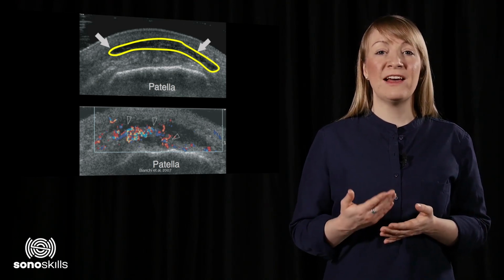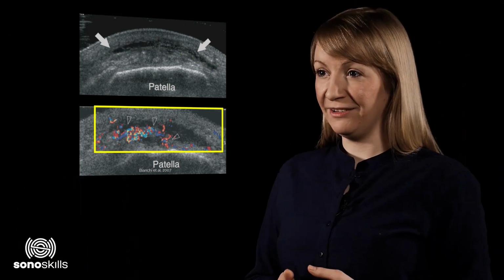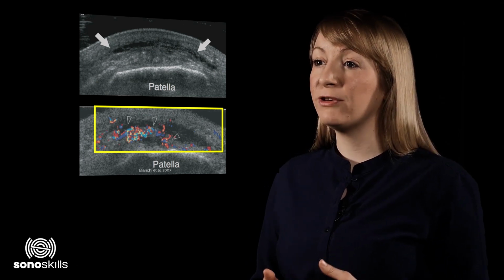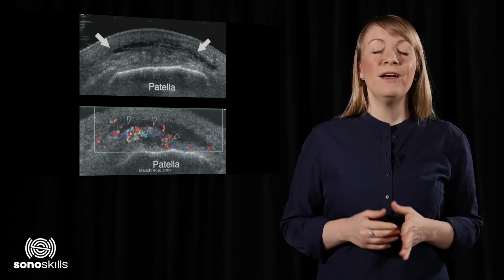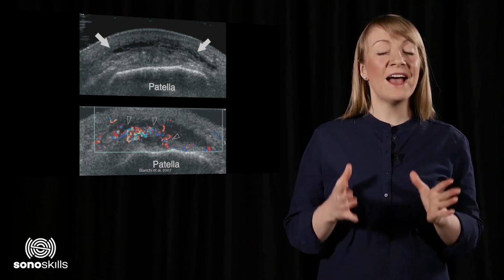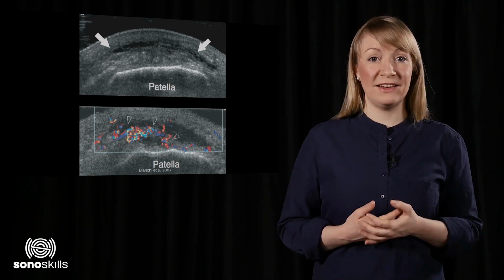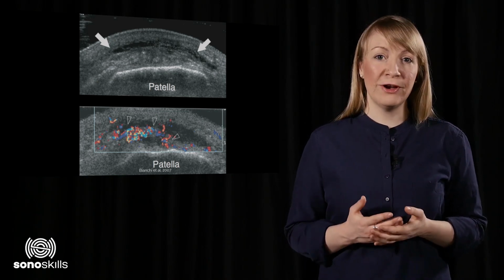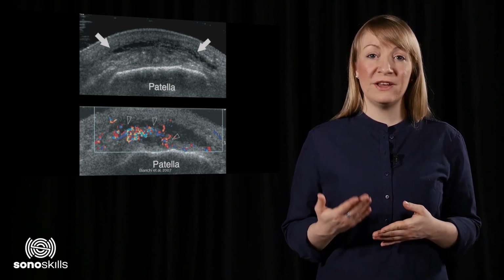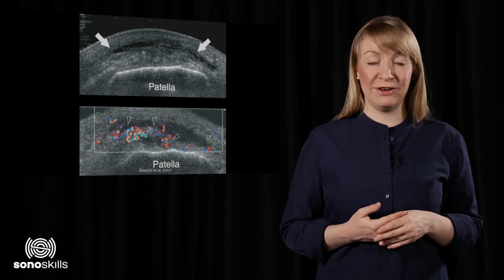This image shows that the pre-patellar bursa has changed in shape and increased in thickness. Colour Doppler imaging reveals an increased vasculature within the thickened bursal walls, reflecting inflammatory hyperemia. Based on this static image, it cannot be confirmed whether there is a functional problem. We can assume, based on previous findings, that this patient shows an acute pre-patellar bursitis. This conclusion should be confirmed by scanning both longitudinally and transversely. Measurements of the bursa dimensions have to be made to accurately document the pathology for diagnostic and/or evaluative purposes.